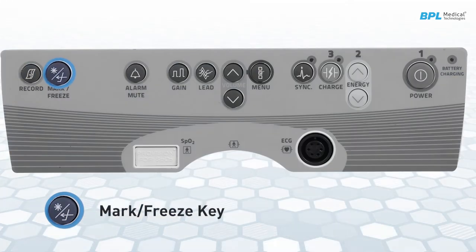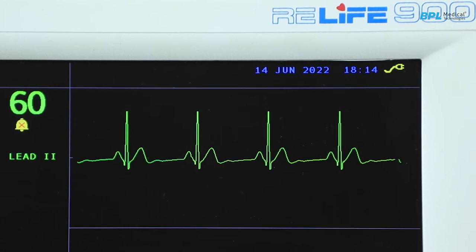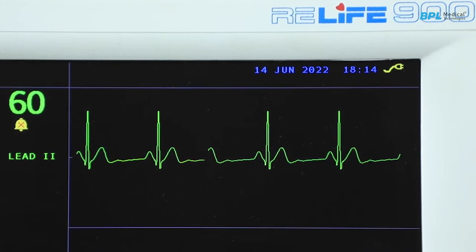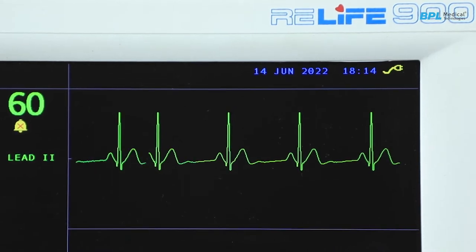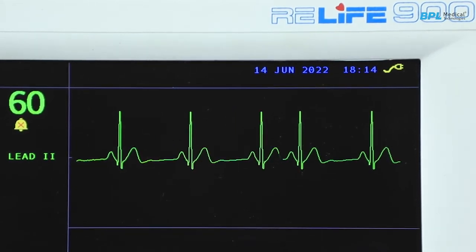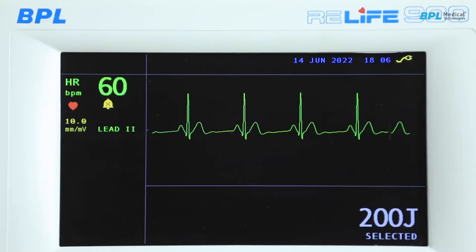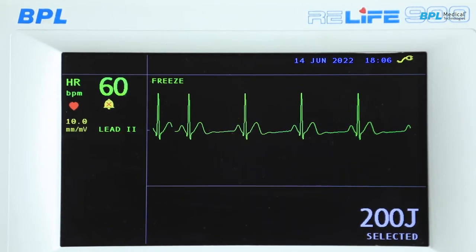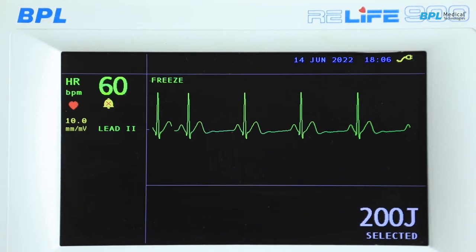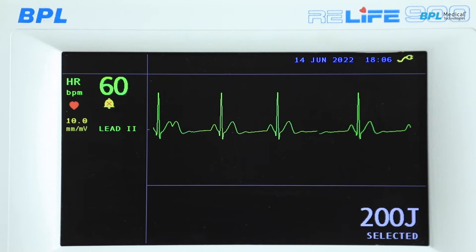Mark freeze option. This key can be configured as a mark key or freeze key in the main screen menu. If the key is configured as a mark key, then it functions as an event marker to mark and store the ECG data. When the key functions as a freeze key, pressing the key will freeze all the displayed traces on the screen. This is indicated by the message freeze on the display. Pressing the key again will remove the freeze condition.